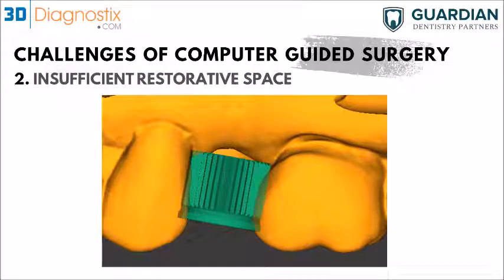So let's say a pilot sleeve. The guide would only provide you with guidance for the initial osteotomy, and then you remove the guide and continue freehand. Then you can either just crown the teeth, or maybe just shave them a bit so you have enough restorative space mesially to restore that implant. This is also one of the things we see in a lot of cases that we process.